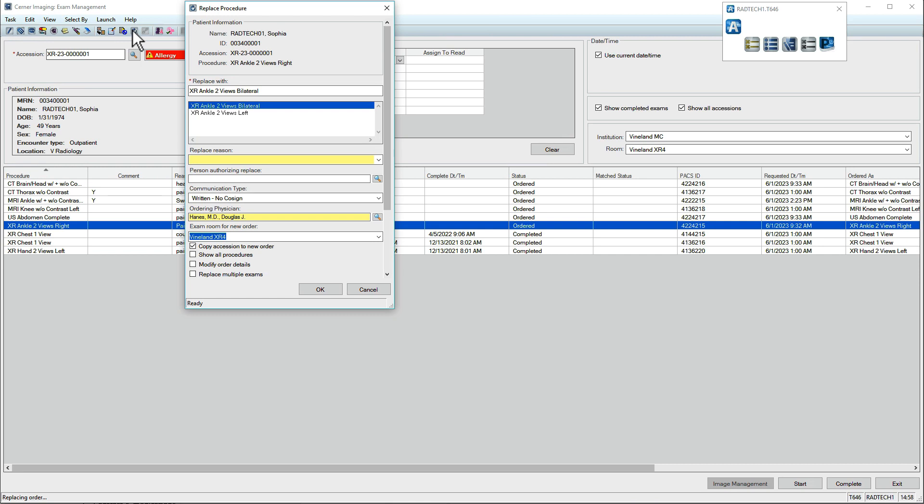In this example, an order to image the right foot has been entered, but it's the patient's left foot that requires scanning. This replacement can be made.